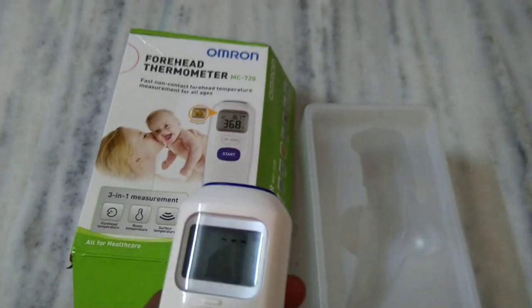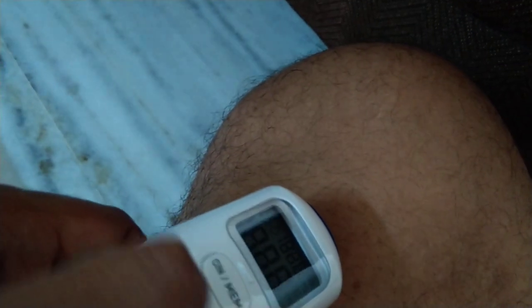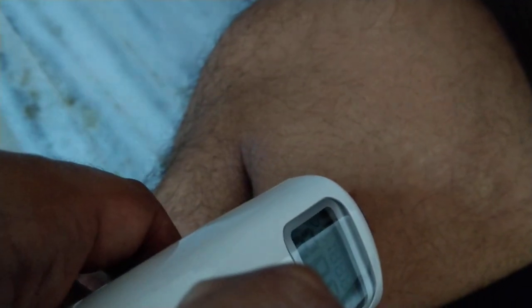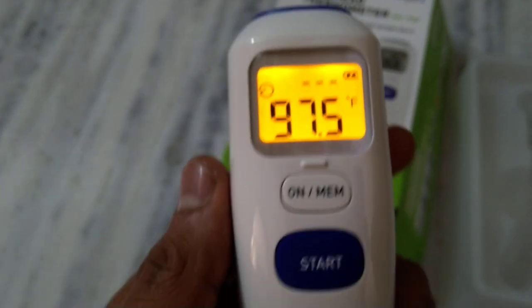To measure the temperature of any object, just place the device on it and press the button — it takes about one second. Now you can see it has shown 97.5 degrees Fahrenheit.